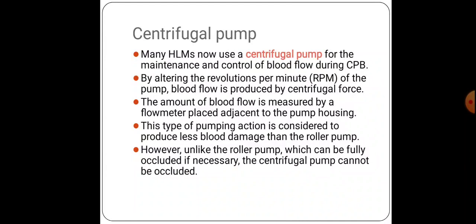However, unlike the roller pump, which can be fully occluded if necessary, the centrifugal pump cannot be occluded. Occluded means compression, reducing the diameter and extending the length. So the roller pump can be occluded to any extent, but the centrifugal pump is not occluded.